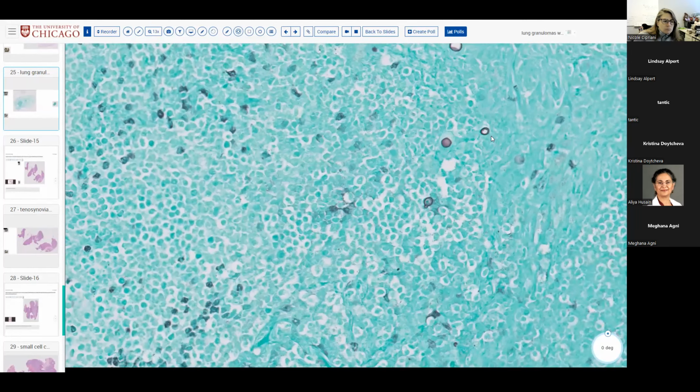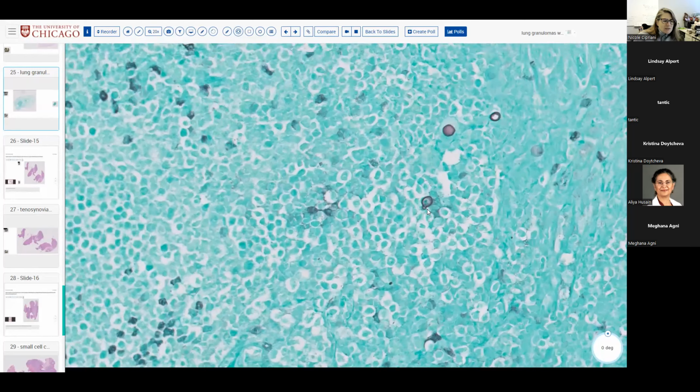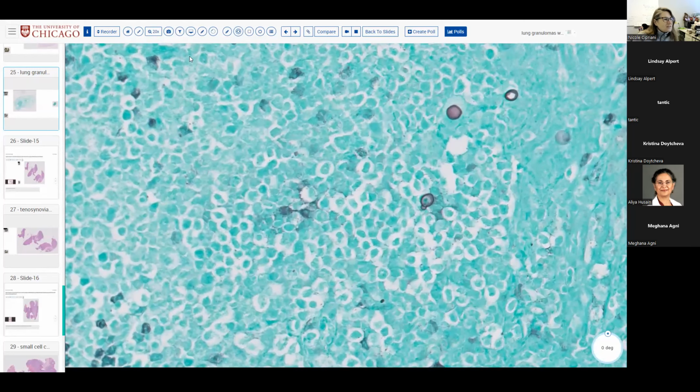Cool. Okay, that's nice. There they are. Yeah, that is a good bud, but it's a little one.